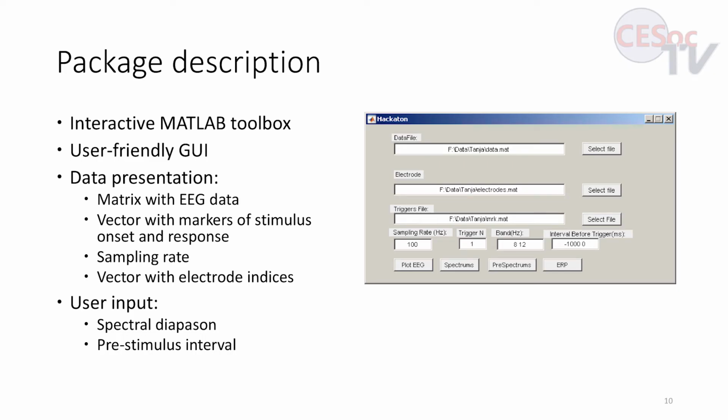And now we have a lot of tools to analyze data from different modalities, but there was no tool for integration, and so this is why we created this open source package, which is an interactive MATLAB toolbox, hopefully with a user-friendly graphic user interface.